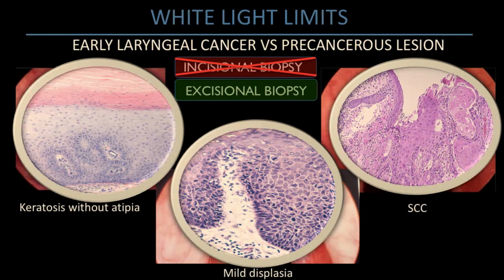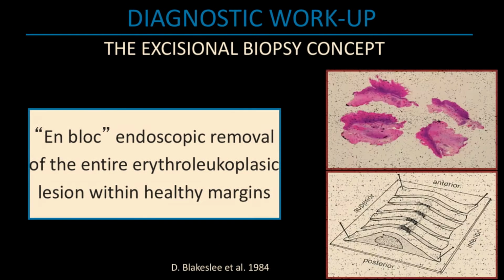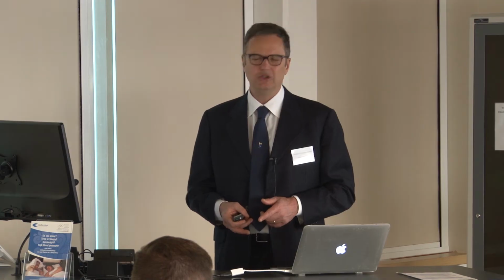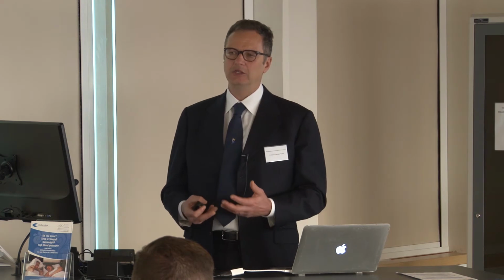So the concept is to perform, in this case, a resection of the entire lesion in clear margin, to have the possibility in only one procedure to perform diagnosis of the entire lesion and to precisely evaluate the margin of the resection. So you don't need to perform a staging microlaryngoscopy. You can do both things in the same procedure.